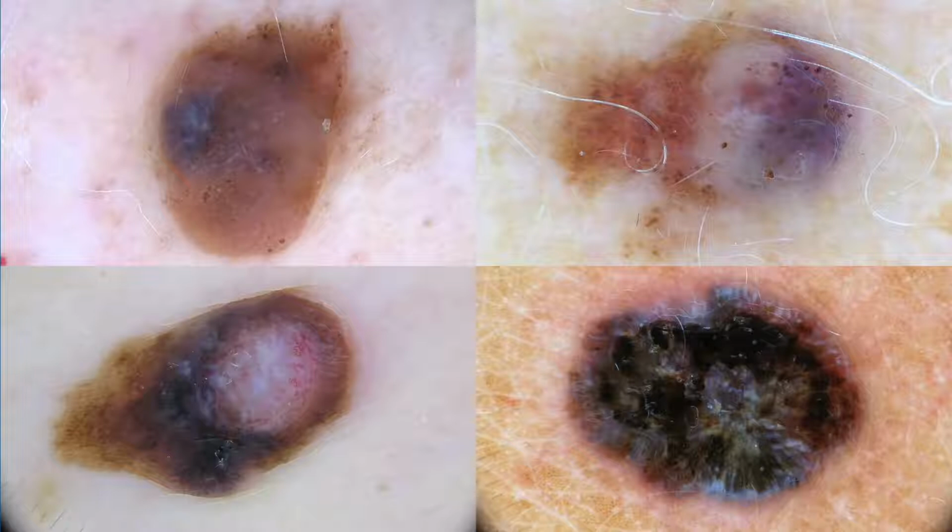Meanwhile, we have these lesions which are slightly raised. Some of them have blue colors, polymorphous vessels, shiny white structures, and multiple colors. So these are probably invasive melanomas. And if you guessed this, you would have guessed correctly.